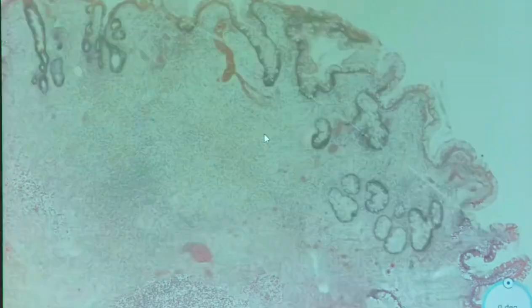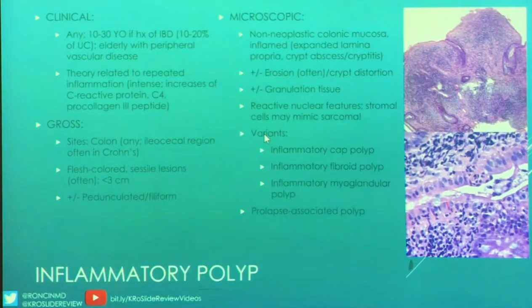So, okay, this was my one real moment in lecture where it's like, this is not neoplastic. But you see them all the time, and as a first year, I saw these and they freaked me out. So I thought it would be a good idea to put them in the polypoid section. But yeah, this is an inflammatory polyp that can happen at any age.